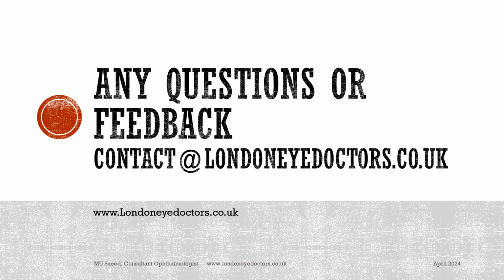This should give you some more idea of the importance of OCT scans and why, as doctors and ophthalmologists, we order OCTs for a lot of our patients. These do help in a number of eye conditions, and because of these, prognostication, diagnosis, and treatment is helped quite significantly.